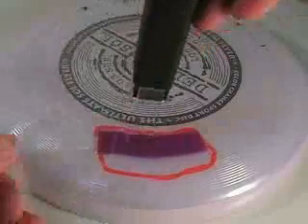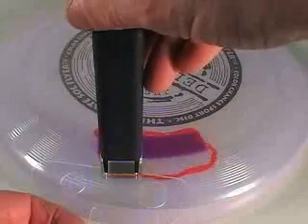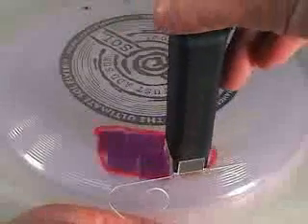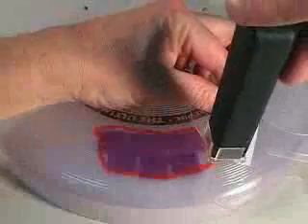To treat the entire lesion, the handpiece moves from one skin segment to another. A clear plastic template is provided to protect uninvolved skin from exposure to UV light. It takes only minutes to treat an area of localized disease. Treatment regimens for psoriasis normally involve treatment sessions performed twice per week for 3 to 6 weeks.